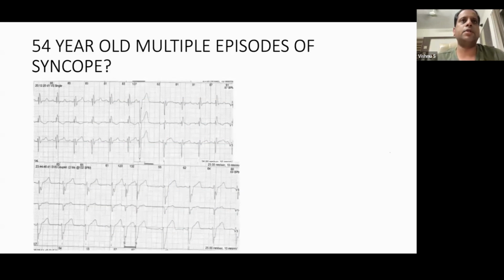If the same patient has RBBB in one ECG and LBBB in another, or alternating bundle branch block in one ECG, he is a candidate for pacing at the earliest, as it is an unstable escape to complete heart block. This much only. Over. I think you can have a discussion from here.